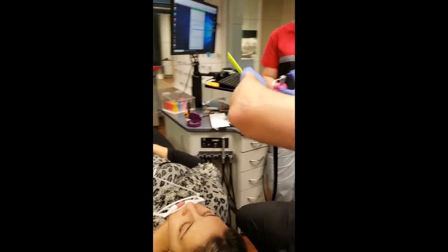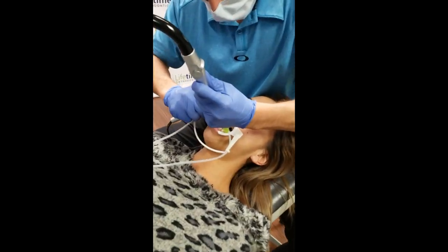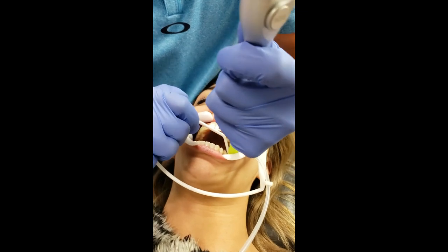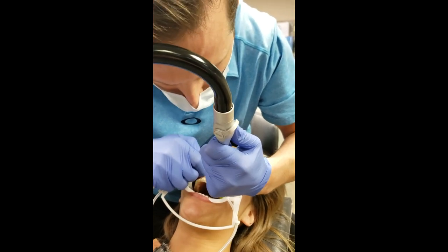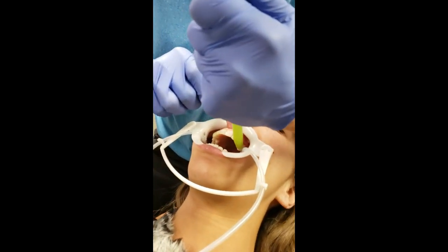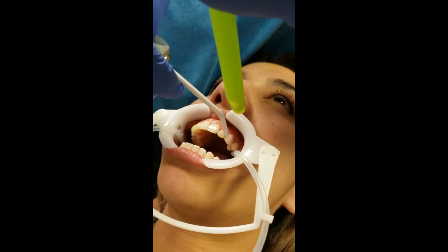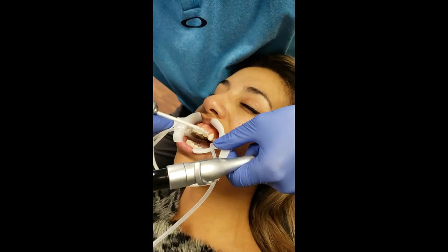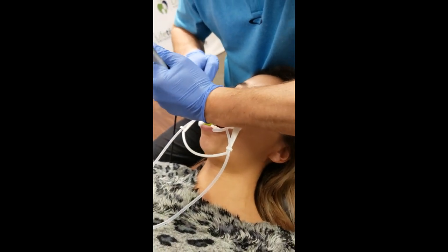We can start our rinse - open for me. I like to get the suction right on there with barely any water getting out; that's most comfortable for the patient. A good rinse is just as important as a good etch. A big thing is we want to get it really good - like that. If you don't get that chalky look you have to re-etch it. The top reason we don't get a good etch is if there was a bracket on there before and we didn't completely clean the adhesive.